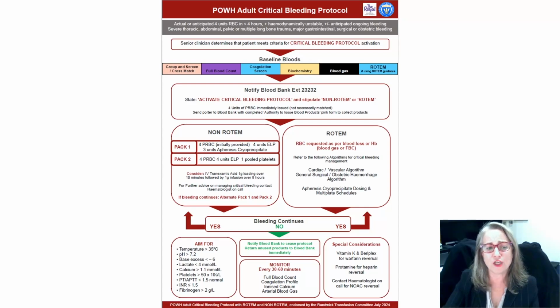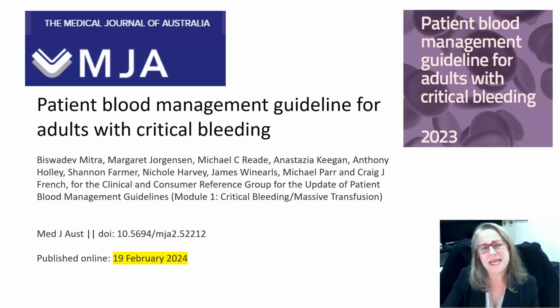It talks about basic parameters with a fibrinogen greater than 2 as your goal. It talks about what to monitor and how often, and a little bit about Beriplex and when to consult a haematologist, such as if there's NOACs involved. And also, of course, to cancel the protocol when you're finished.